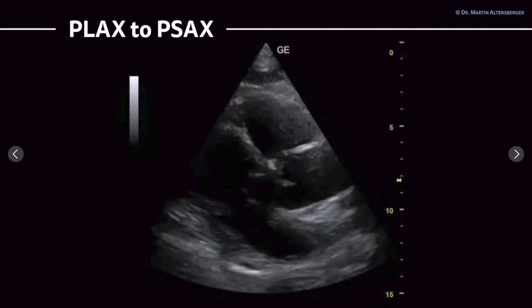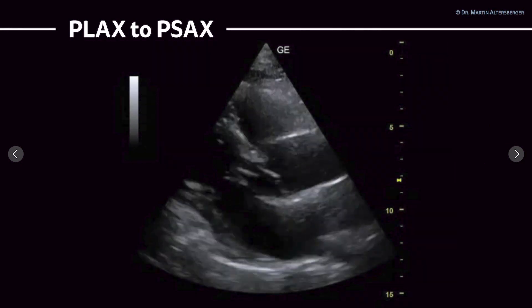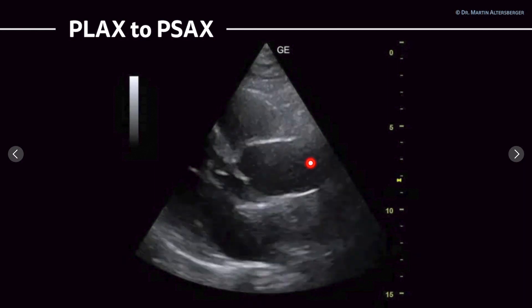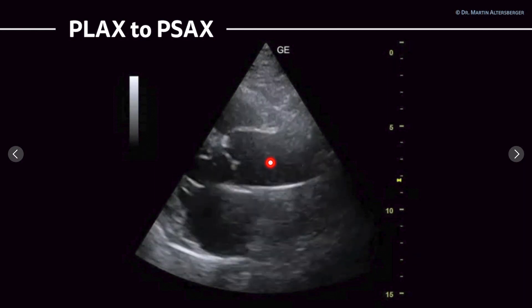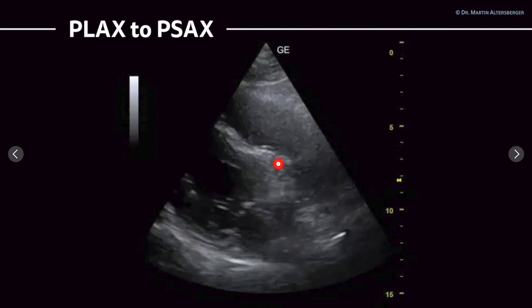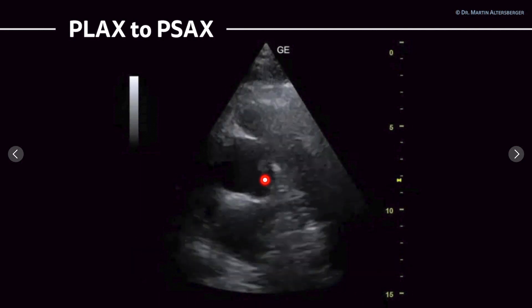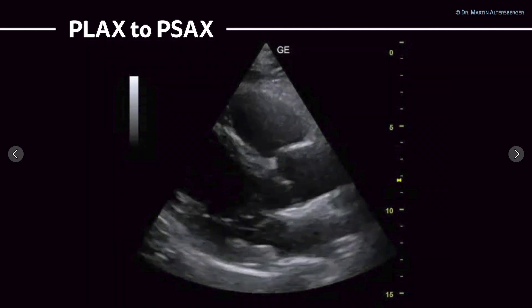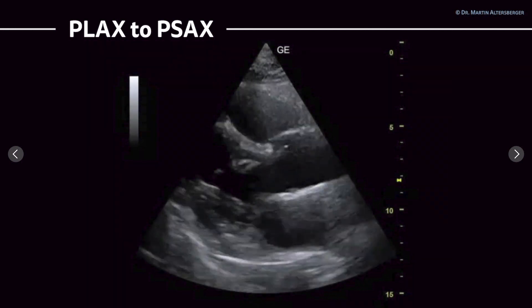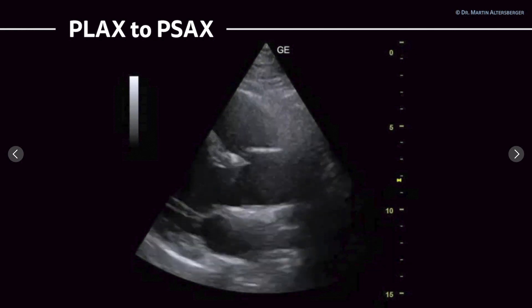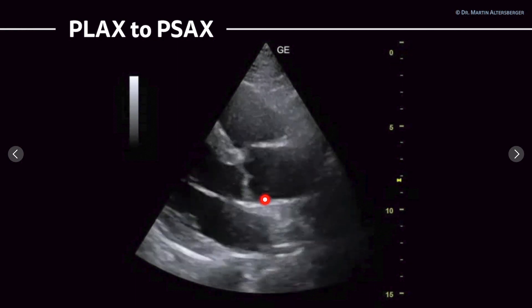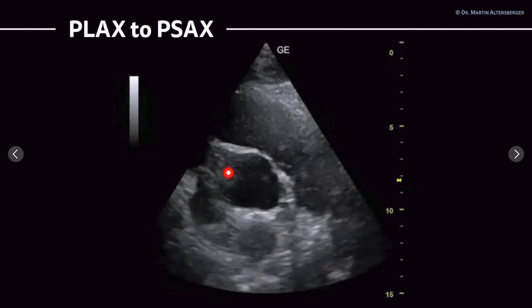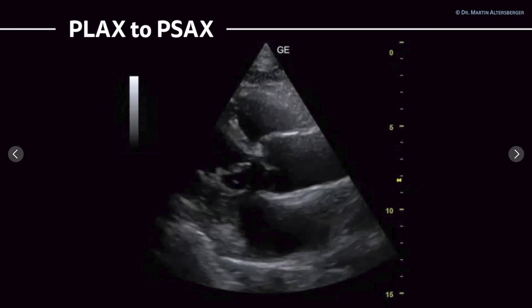To get this view, you start in the parasternal long axis view — this is the aortic valve, the mitral valve, left atrium, left ventricle, ascending aorta — and you keep the aortic valve in the center of the image and rotate. When you always kept the aortic valve in the center, you achieve a parasternal short axis view of the aortic valve.